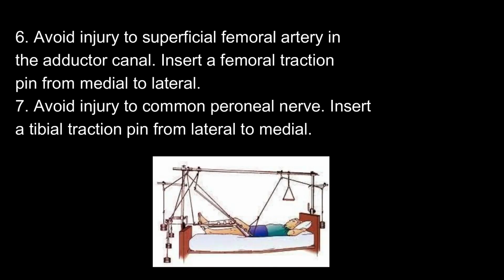6. Avoid injury to superficial femoral artery in the adductor canal. Insert a femoral traction pin from medial to lateral. 7. Avoid injury to common peroneal nerve. Insert a tibial traction pin from lateral to medial.